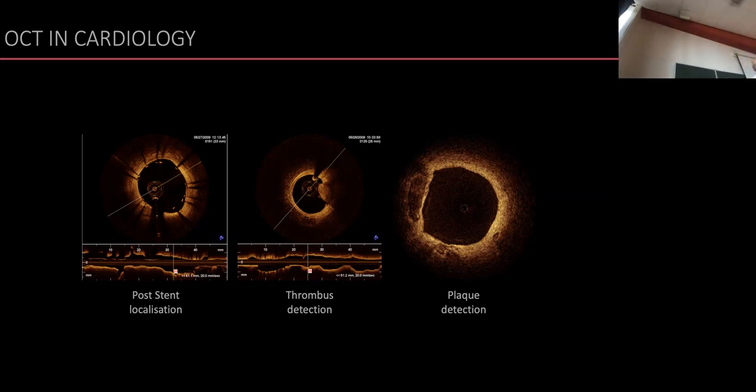That's a good point. What you see here, maybe the middle one is the best one to look at. We bring in this catheter, right? And it's in a tube, an artery. So it's a luminal cavity. We flush away the blood. So that's why we can look through it. It's empty. But in the middle, you can see this round structure. That's basically the probe itself. The probe itself has some mirrors and some optics there that gives a tiny reflection. So during the scanning, it creates a circle of that tiny reflection itself. That's what you see here.